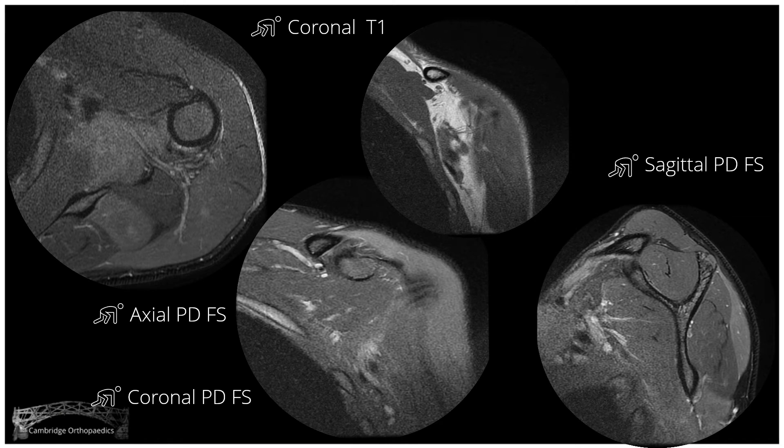What do you think of the greater tuberosity? What do you think of the supraspinatus muscle and tendon? Why can't he elevate his arm? Did you notice the increased signal on the T2 images — the proton density fat-suppressed images — within the deltoid and within teres minor? Did you see the greater tuberosity healed with minimal displacement on the proximal humerus, and supraspinatus tendon and muscle in continuity?